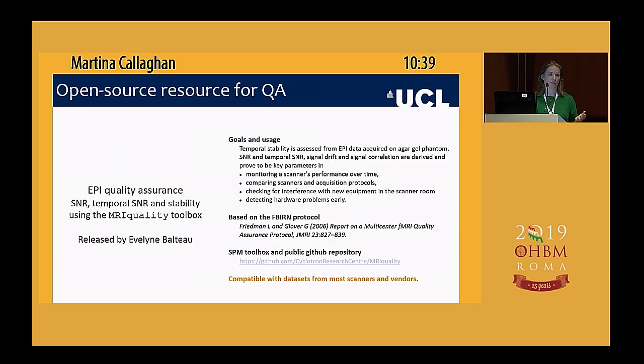If you don't have this type of QA procedure implemented at your center and would be interested in doing so, Evelyn Balto in Liège has put together a toolbox which basically does the type of analysis that I was showing you in the results that we have at our center, produces all of those different metrics, and she has made that publicly available, so you can download it from GitHub and use it to assess all of these different measures and see how your system is performing too.